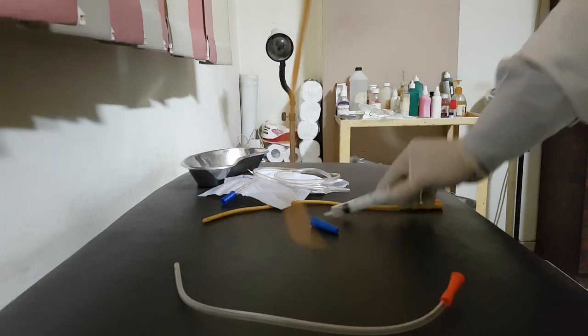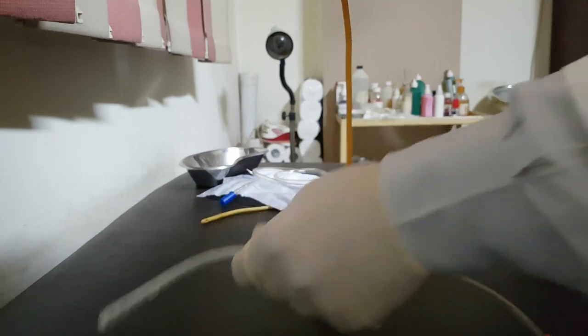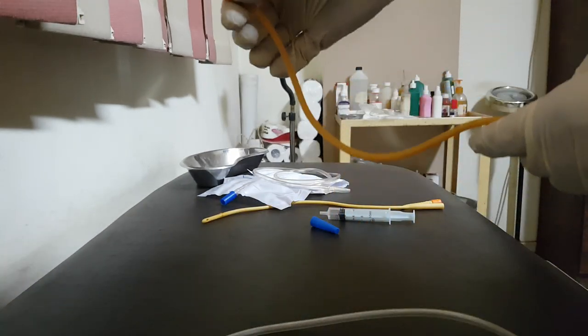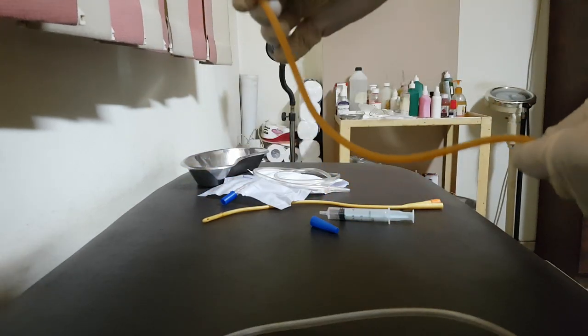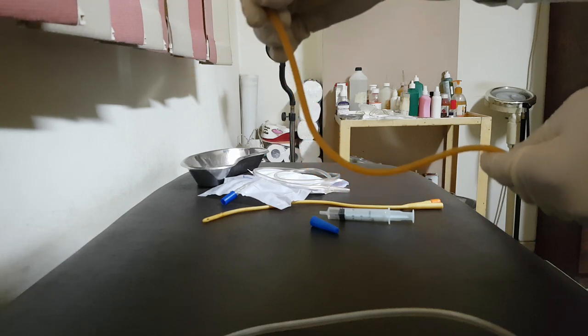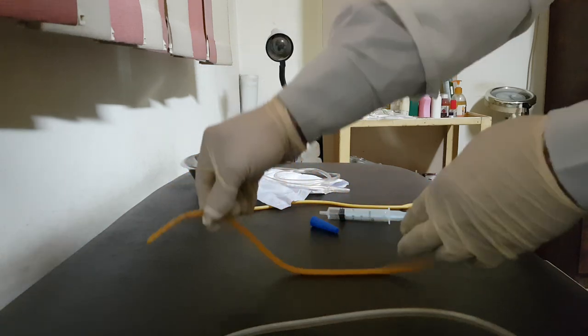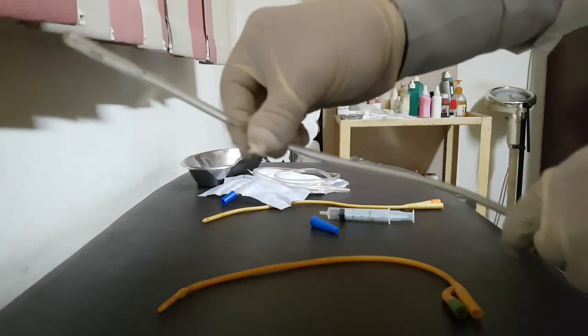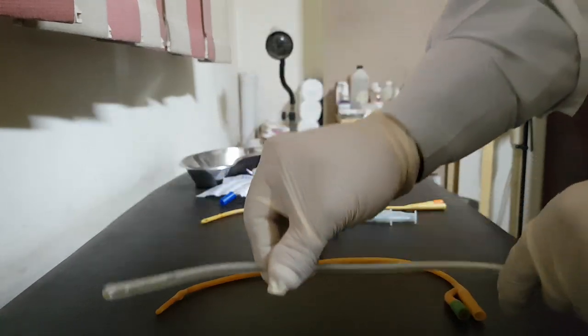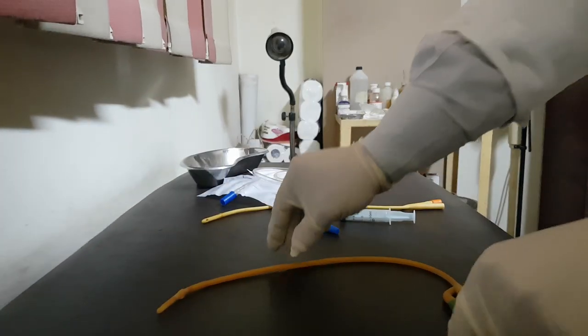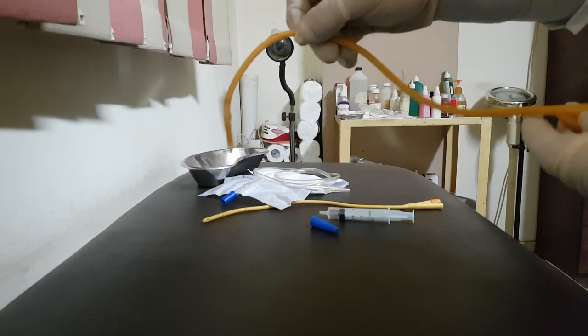So Foley catheter is different than Nelaton in having this balloon. Why this balloon? To keep the catheter inside the bladder for longer time. So we call it indwelling catheter. It can be used for days, weeks, and so on. While Nelaton catheter is used only at the same moment to evacuate the bladder then remove it. So it is not fixed in place. But Foley catheter is fixed through this balloon.